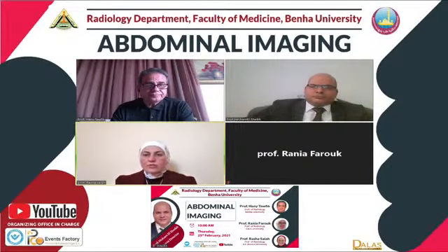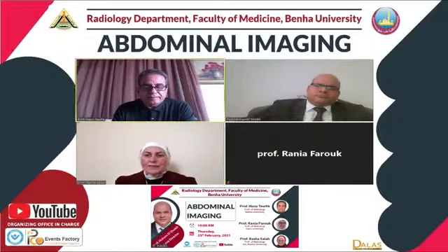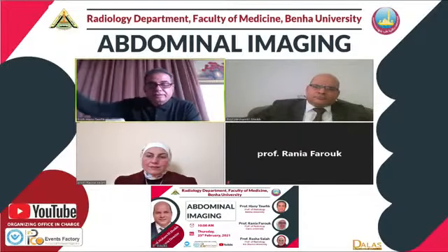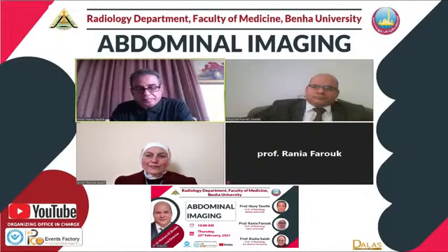في modality هو زي ما حضرتك الحكاية دي. هو الـ best imaging tool للبريتونيوم هو الـ diffusion weighted image في الـ MRI. ده بيأسس along الـ peritoneal reflections all over، يعني الـ para-hepatic ساعات بتبقى باينة جدا في الـ diffusion عند الـ paracolic gutters اللي هي الحتت الـ hidden كمان من الـ peritoneal reflections بتبقى باينة بالـ diffusion weighted image. فده بيبقى very helpful tool، ده أحسن imaging tool للـ peritoneal disease هو الـ diffusion. بس يعني هل ده بيبين؟ طب ما هو ما بيبينلناش، هو بيجي يقول في extensive tumor واخد كذا وكذا وكذا، بس مش قايل إن في peritoneal، ما بيشوفهاش. يعني في حاجة تشوفها اللي هي scatter دي all over the peritoneum، ودي أيوه ما بتتشافش.